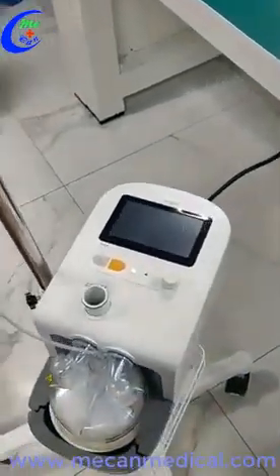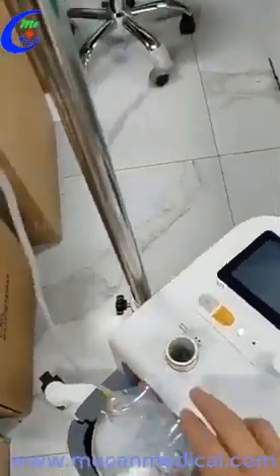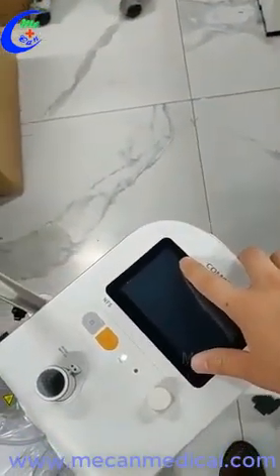As you can see, this is the overview of this product. This is the water tank connected with the water. And this is a gas outlet. And here is the 4.3-inch touchscreen.